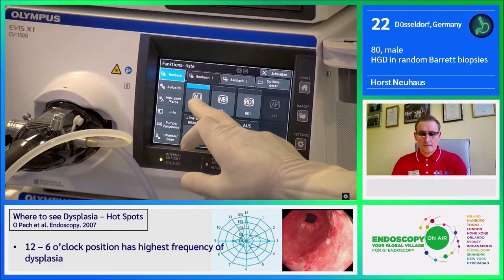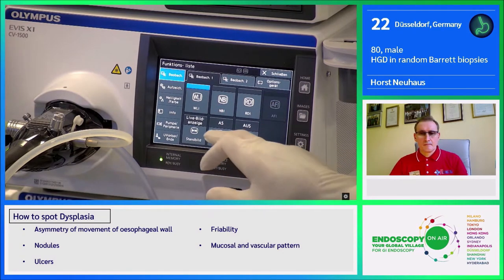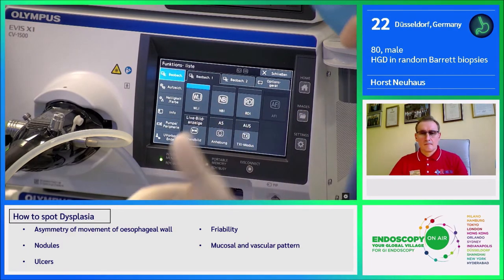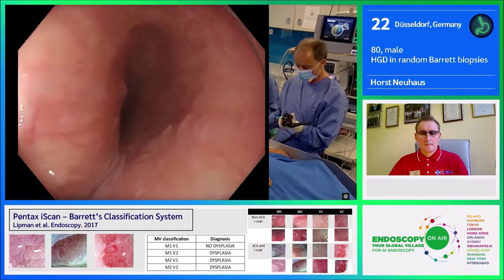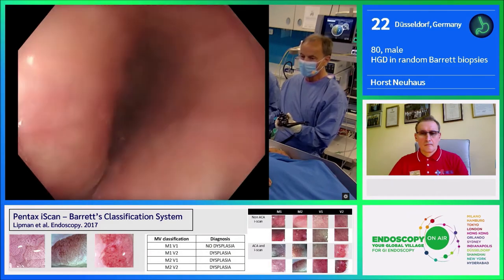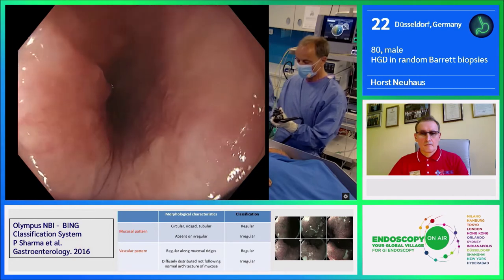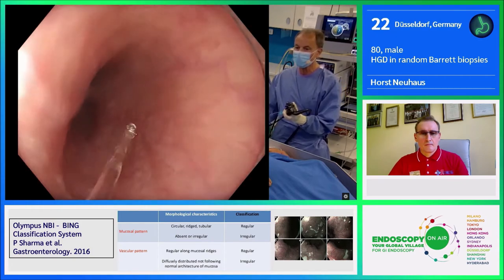I will demonstrate white light endoscopy. We have NBI, RDI, and TXI, which I'll show you and explain how patients benefit from this advanced imaging. I'm using an endoscope of this new generation — the EZ1500, 9.9 mm in outer diameter, similar features as Xera 3 but with a different handle for better ergonomics, a 2.8 mm channel, and integrated waterjet for flushing.